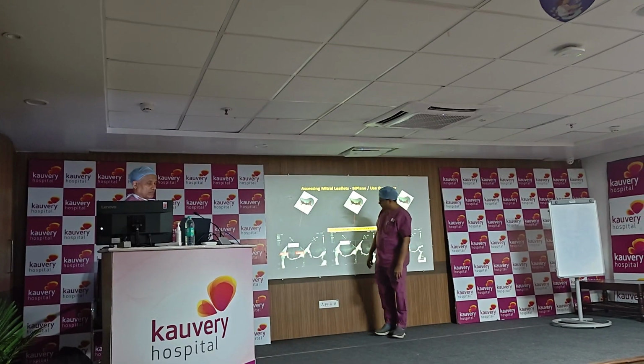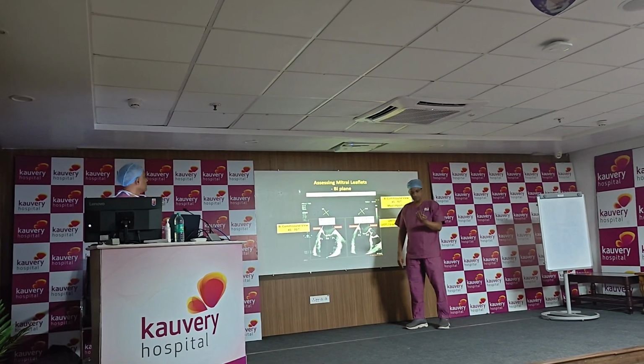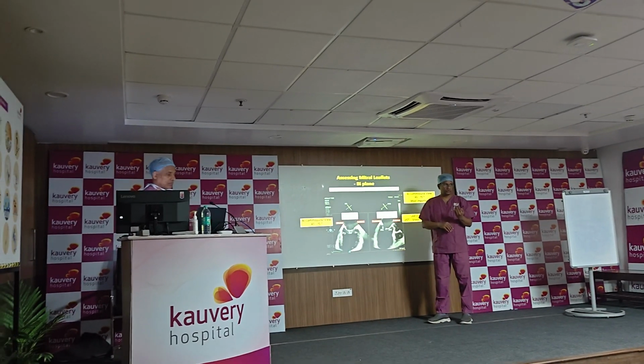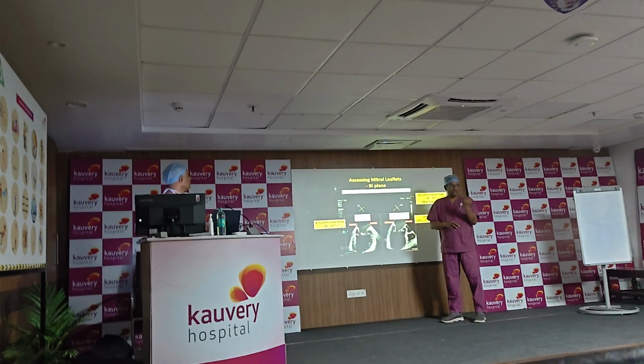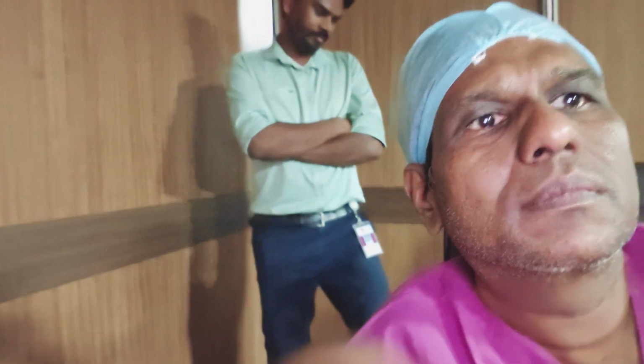So in today's case we put two clips. When we put two clips, if we put the first clip in the middle, then going medial will be very difficult. So that's why, if we have to put a second clip, we usually go a little bit more medial with the first one, so we create a larger gap on the lateral side. And I would have left it.